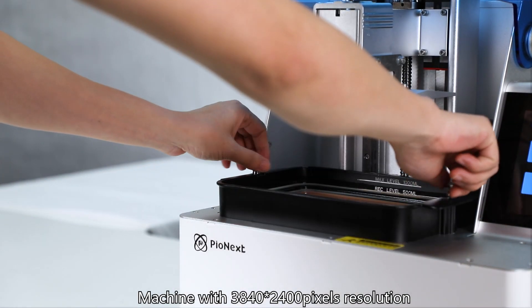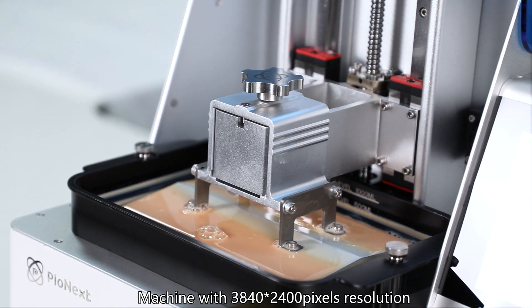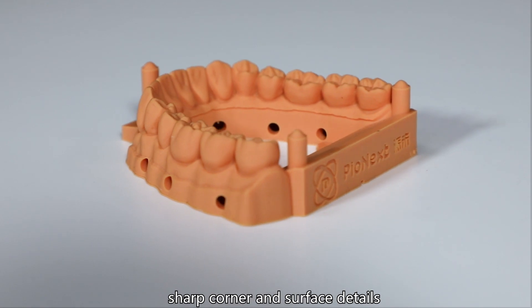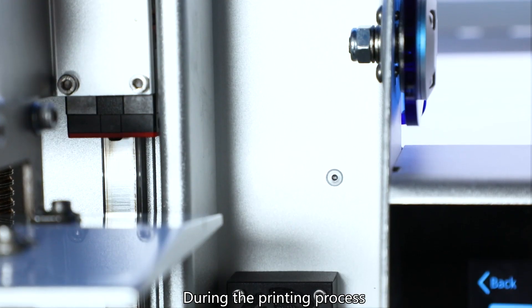The machine features 3840 x 2400 pixel resolution, clearly showing the model points, sharp corners, and surface details.